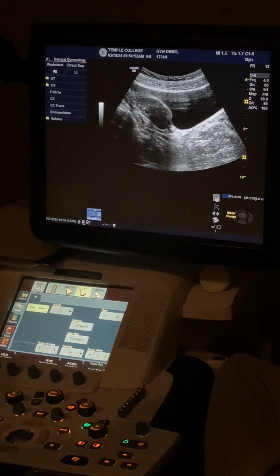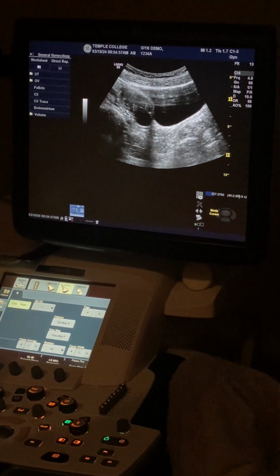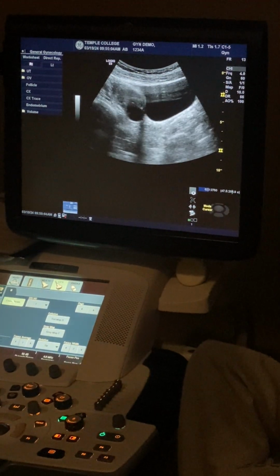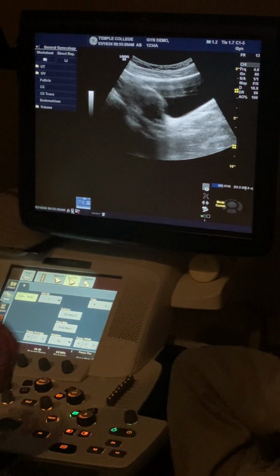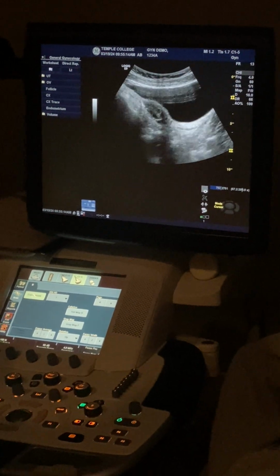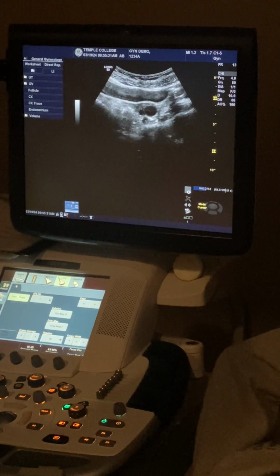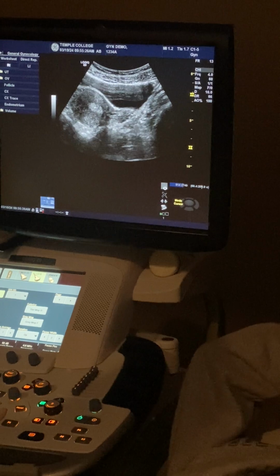But if I show you this picture, do you know that that's there from that image? No. So if that's there, show me that. Document that, please. Okay? Show me this, this, this. That's it. 3 little pictures, ovary's done. And if they have a tiny ovary, it's 2 pictures. She's a little bit plumper ovaries. So when we're doing the transverse images, you don't have to label them superior, mid, inferior, but show me, hey, that's what's hanging out at the superior, but here's mid for a measurement, and then there's the rest of it.